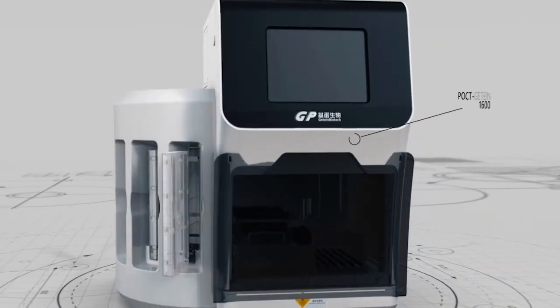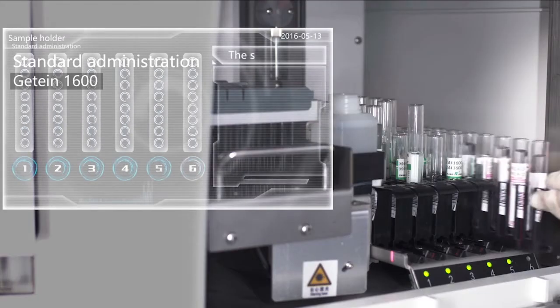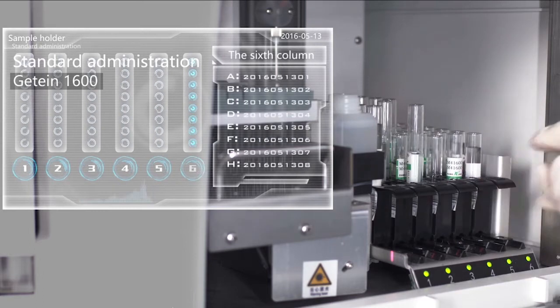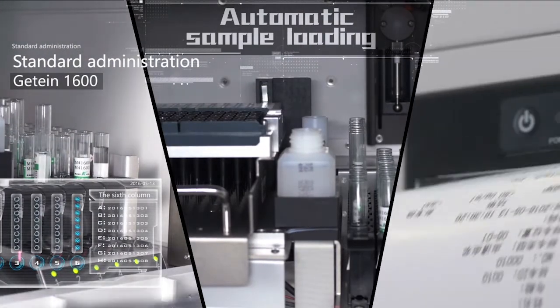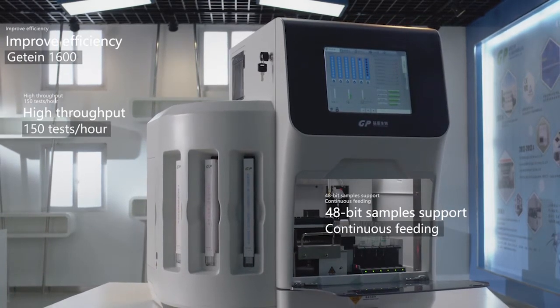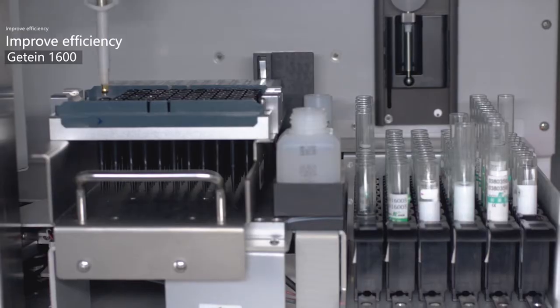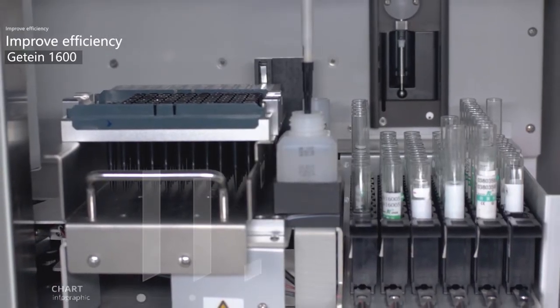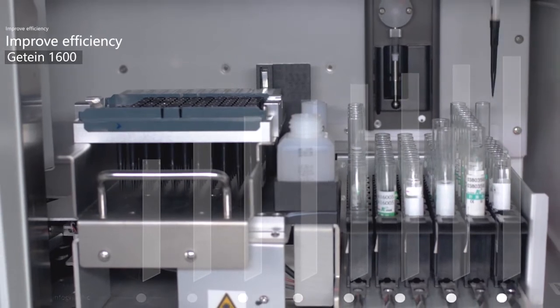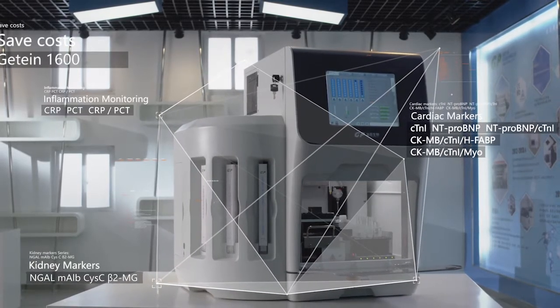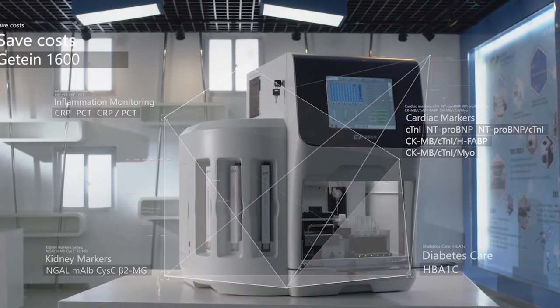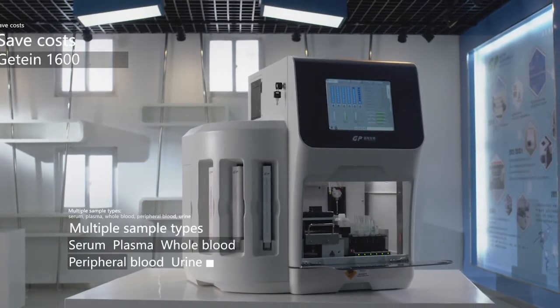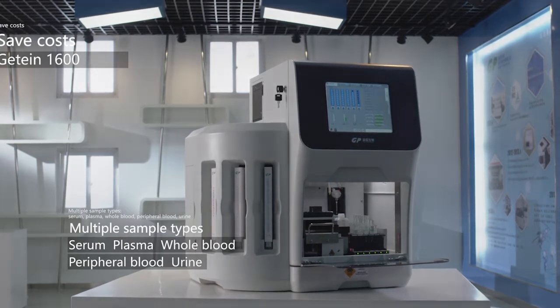Getein 1600 employs an automatic testing system which could automatically run the tests without too much human intervention. The instrument has three loading ports for strip holders, and each holder contains either 48 or 24 sample cartridges. Samples could be loaded at the same time or in succession and could be tested for multiple items. The emergency mode permits the instrument to stop the auto running mode to allow emergency samples to be tested instantly.